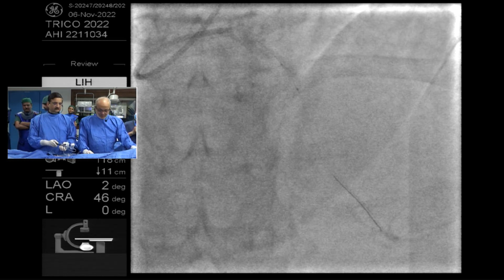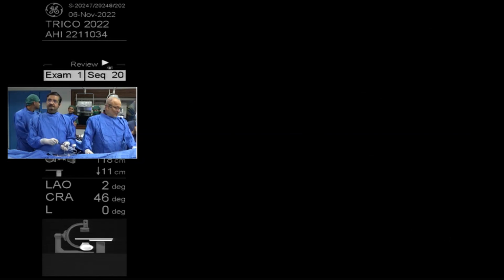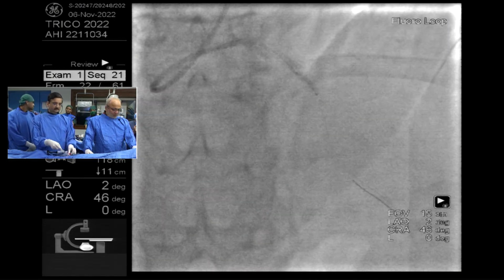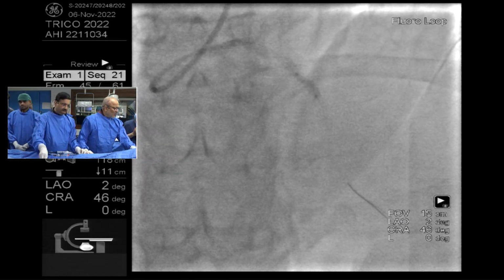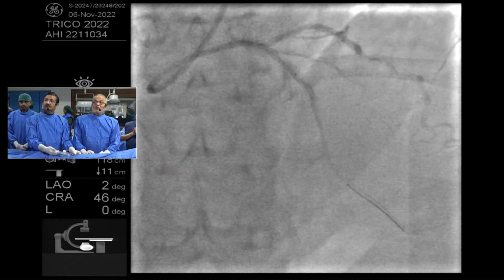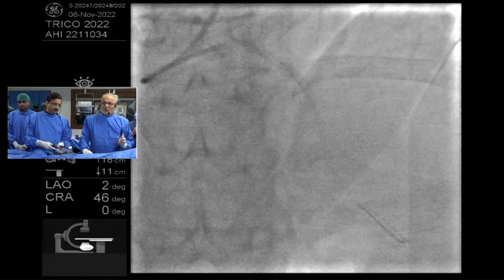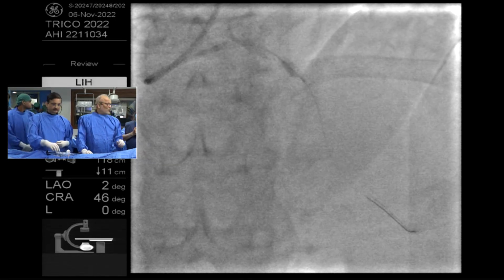I have one question to Dr. Patel. In this type of scenario, very tightly and heavily calcified, should we go from smaller burr to higher, or as you have started, 1.5 is the beginning? Yeah, for a beginner with this type of calcium, I will prefer 1.25. And 1.5 I took because we have done many such cases and we have got away with that in this situation with our experience. That's the only reason. But if you go as per the book, you have to take from small to high. It adds to the cost, but then it makes the thing safe.